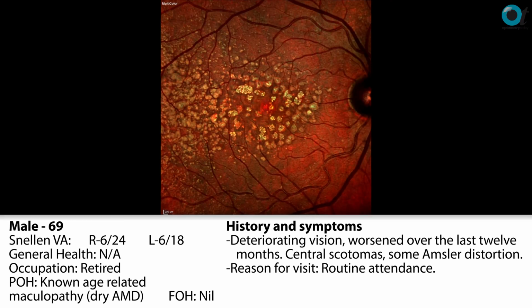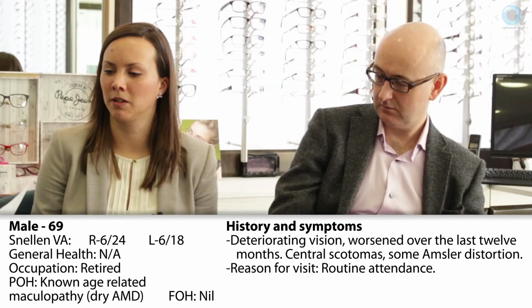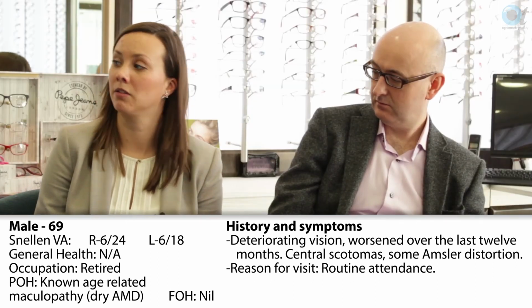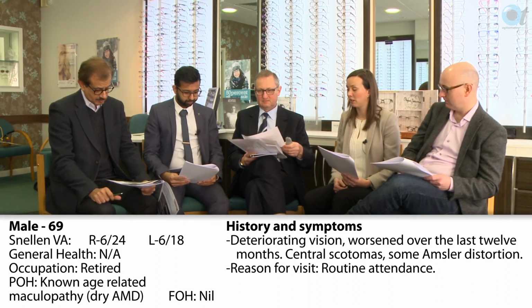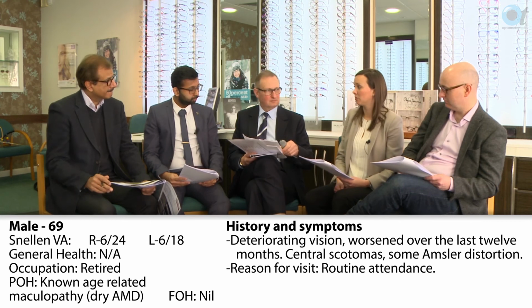Just thinking about if I didn't have an OCT and I saw that appearance on the fundus, I wouldn't have thought it was wet. I can't see hemorrhaging, I can't see grey lesions suggestive of fluid. I think it's just I need my OCT skills to be better in order to make a certain diagnosis that there isn't any leaking here. But if the fundus picture were all I had to work off, I would say that was dry AMD.